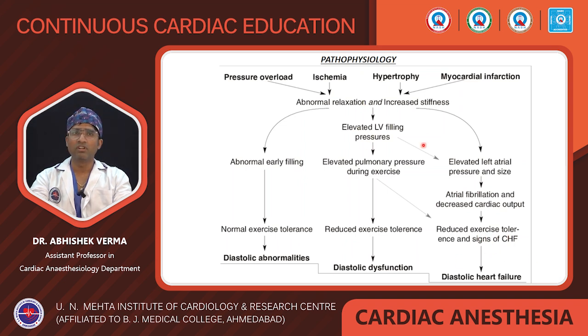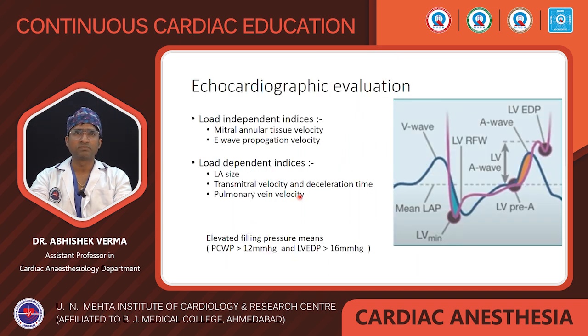Sometimes due to the high LV filling pressure, the pulmonary blood pressure also increases during exercise, which decreases exercise tolerance and leads to diastolic dysfunction. But sometimes the abnormal filling is there with a normal exercise tolerance, which means a masked diastolic abnormality is also there in some patients. So we have to know about these.